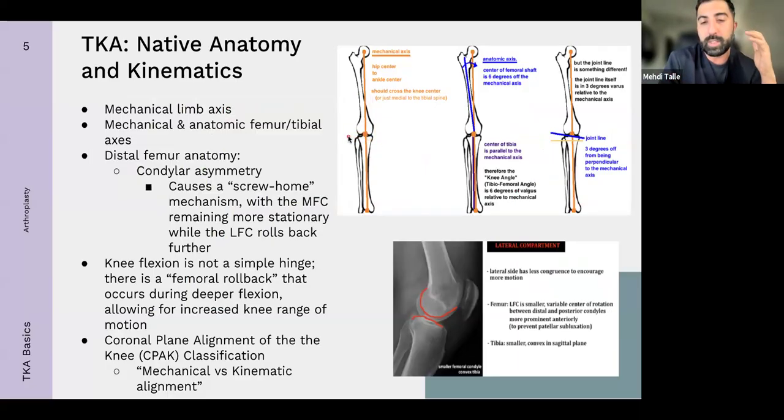It also is conceptually a little bit more palatable when you think about, hey, if I'm putting in implants sideways, couldn't that confer some shear loading on those implants as the years go? But in fact, as arthroplasty evolved over the years, people started to see that there's a whole school of thought that said, hey, if someone's joint line is natively a few degrees off from a perpendicular to their mechanical limb axis, then maybe we shouldn't be trying to artificially create this perpendicular joint line. Maybe it's actually beneficial to put in a bit of joint line obliquity to match their native anatomy.